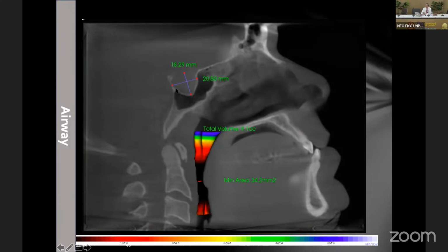Also with the cone beam, you can see there is an enlarged sella turcica. This is about 20 millimeters, certainly much bigger. Normally it's about 10 to 12 millimeters. Some may be as big as 15 millimeters, but certainly not 20. Also the border is not as smooth, and it looks like there is a depression here.